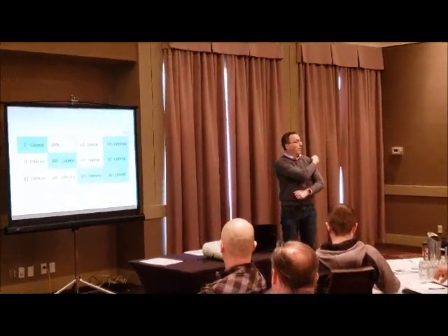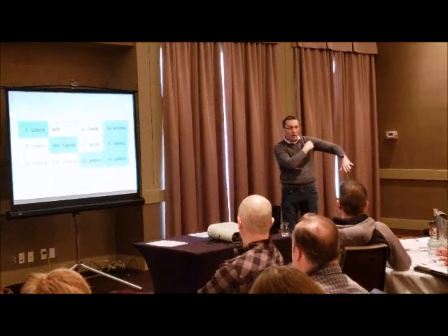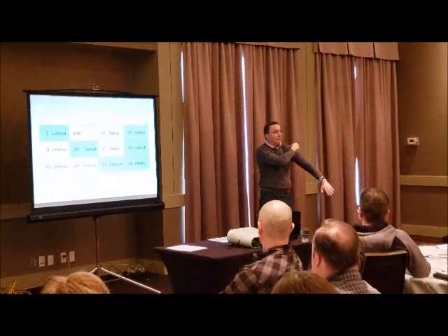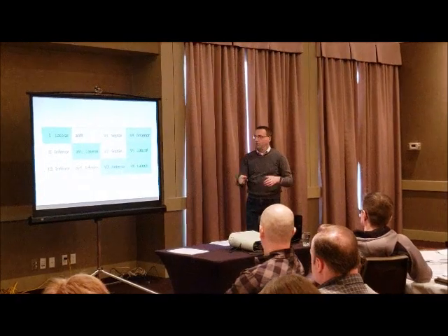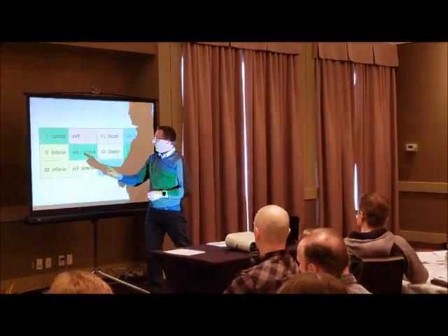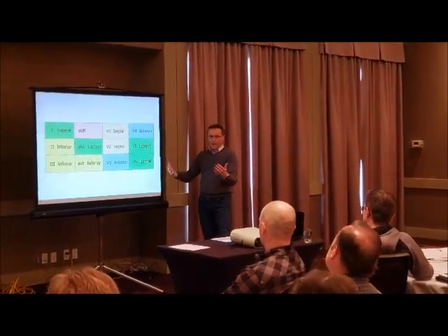And then up on the left arm, the attachment point of the left arm is up here. So high lateral leads, the black electrode up on the left arm, 1 and AVL are derived from that black electrode on the left arm. So we call those the so-called high lateral leads, all right? So you've got the lower left-hand corner, inferior leads, the high lateral leads, the anterior leads, and the low lateral leads. And that's kind of how it's laid out.